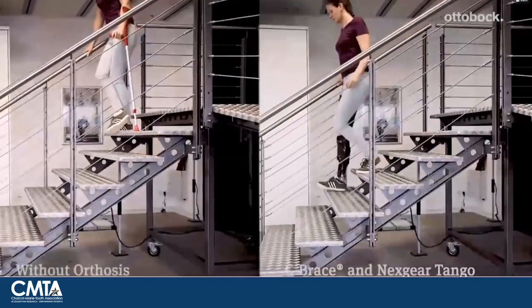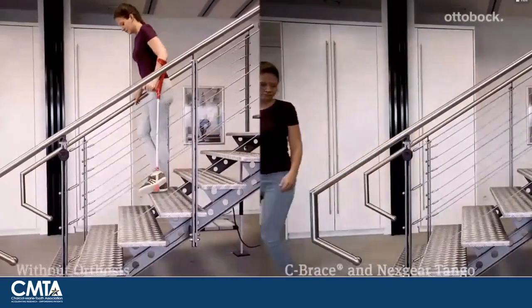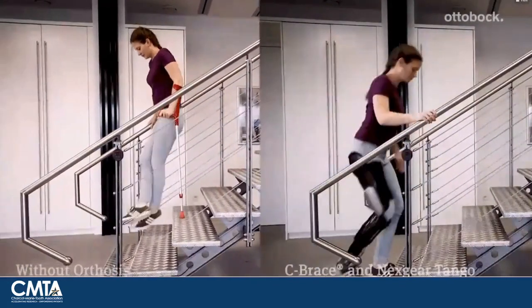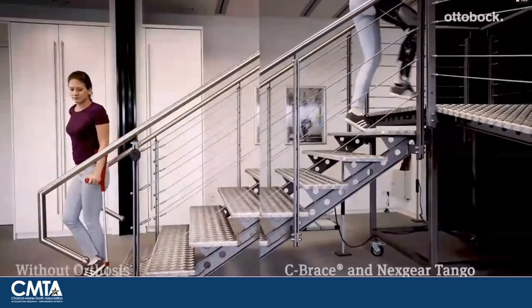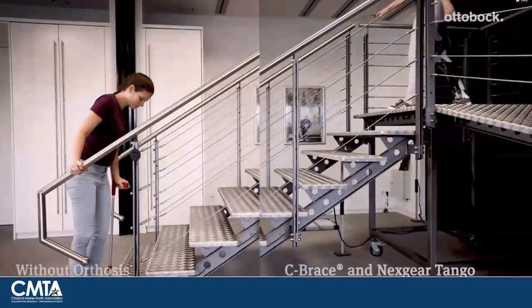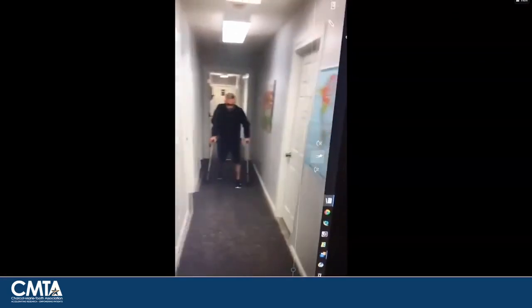Typically going downstairs, again, really this is part of therapy, learning how to do this, right? She wasn't able to do this the first day she got the C-brace, but as she's gotten used to it, she's definitely able to go up and down stairs in a much more controlled manner. So those are some of the benefits.